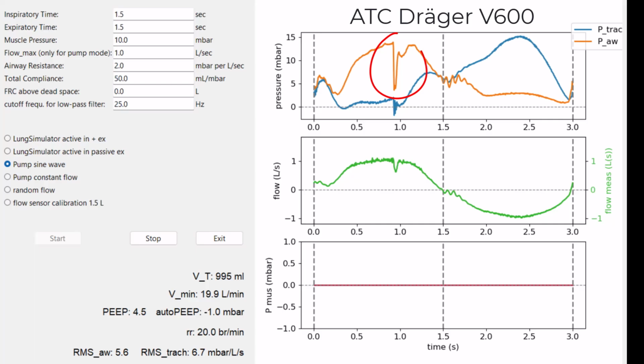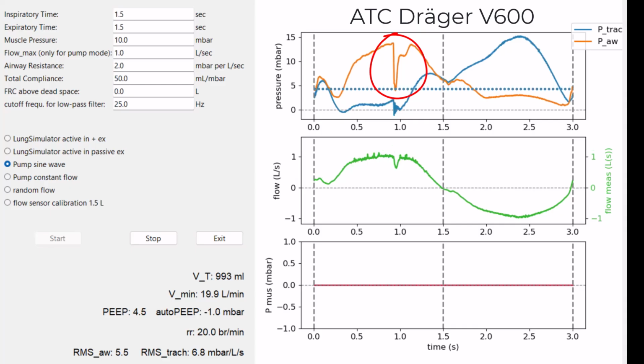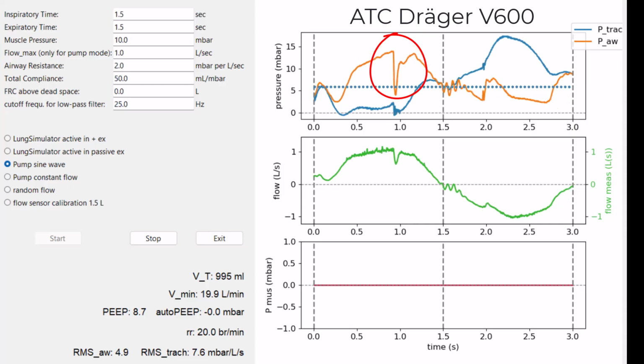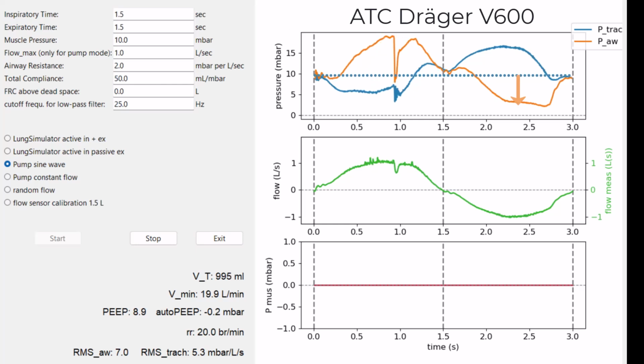And there's something strange happening that I don't quite understand. So the airway pressure has this little dip after about 1 second. I really couldn't figure out why this is. There is no maximum volume or anything that I adjusted here. Anyway, what you now see is that I increase my PEEP level to about 10 centimeters of water, and that allows the airway pressure to decrease more below PEEP, and that gives a little bit better tube compensation.